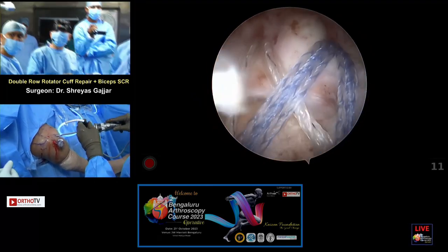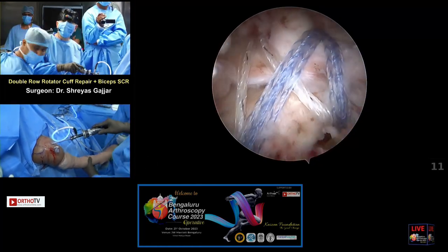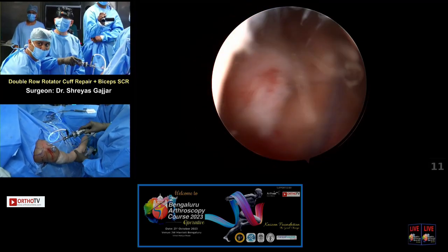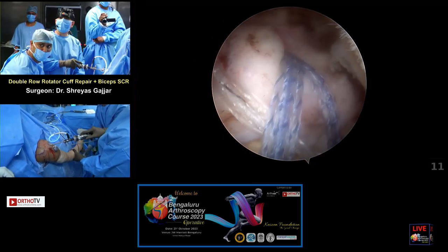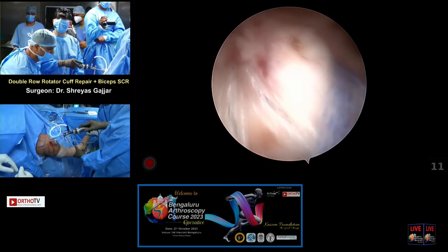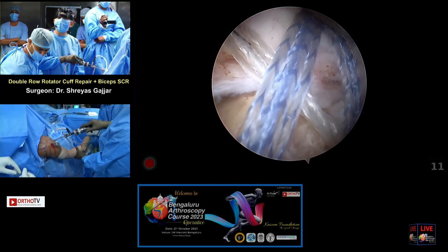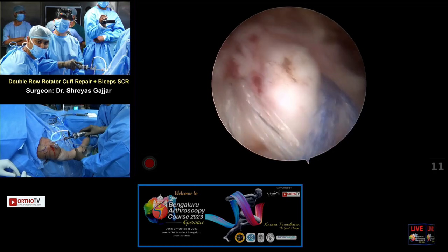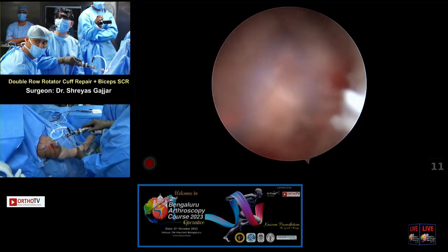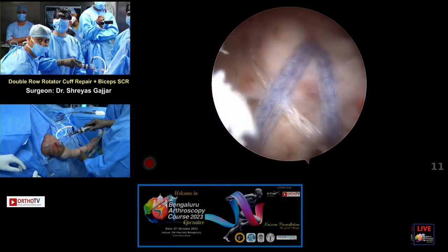So you see, this is the speed bridge technique. Can we rotate the shoulder internally? It's good to maneuver and make sure that you have repaired it. So I'm kind of happy with that repair. You don't want to pull the cuff too laterally because there is tendon loss. If you see here, the muscle tendon junction starts. So this part, there is tendon loss. If you pull it and lateralize it, you may increase the risk of a medial tear. So I'm quite happy with these because these are strong implants. So, degenerate cuff, this is good enough.